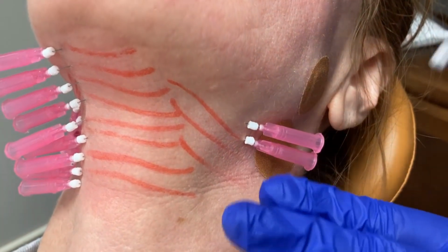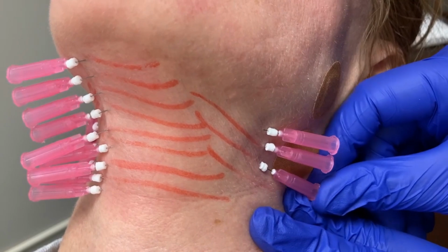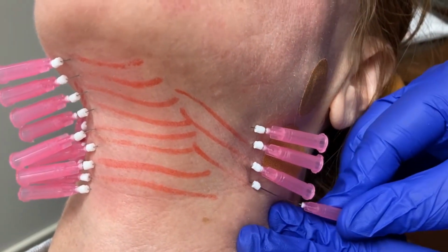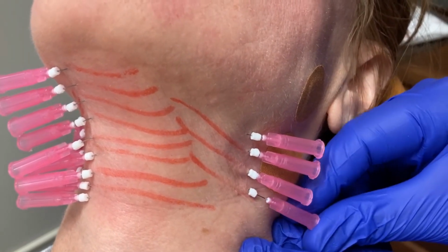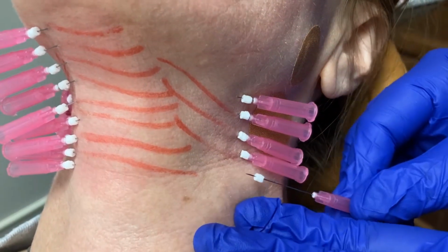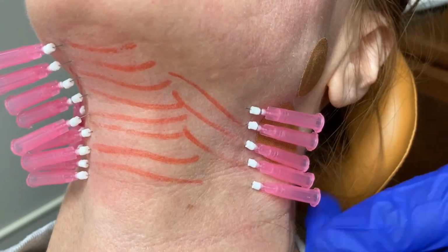If this was any other competing thread, you would need 4 times as many smooth PDO threads. Certainly you've seen some of those crazy pictures, but this goes in just a few minutes if you know the right plane and have been properly trained. So you can see we've treated all these areas very simply. This is going to tighten and lift. We're doing this all in one appointment.